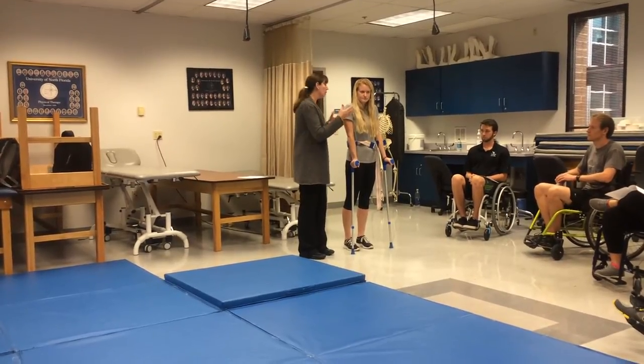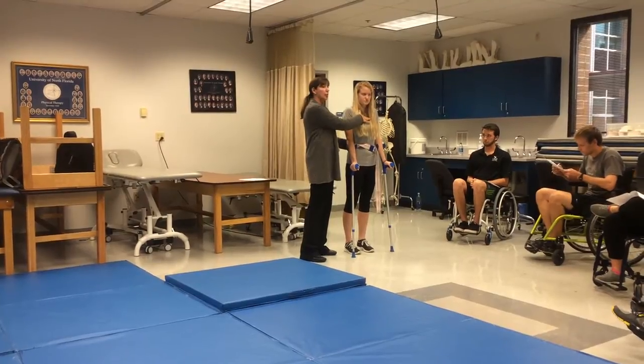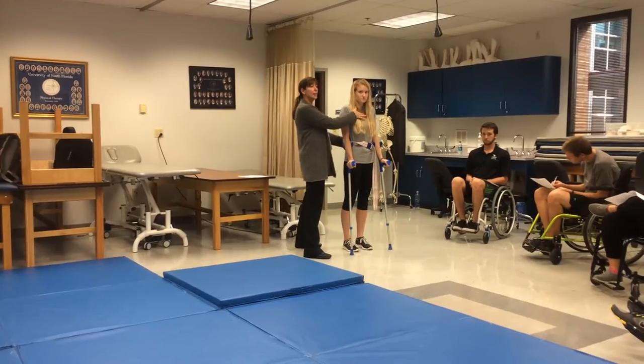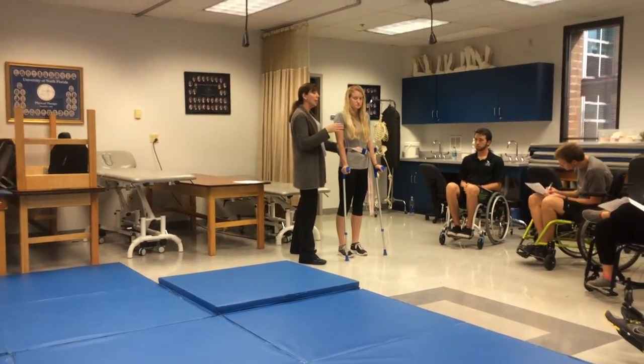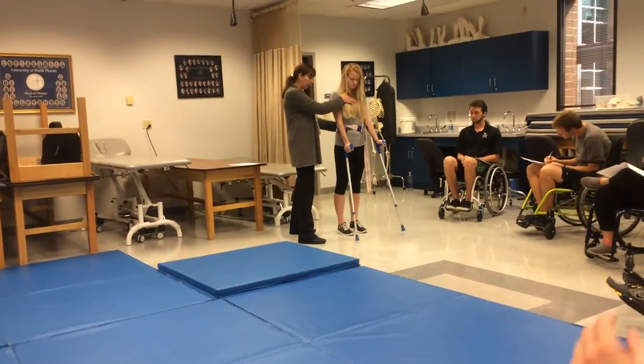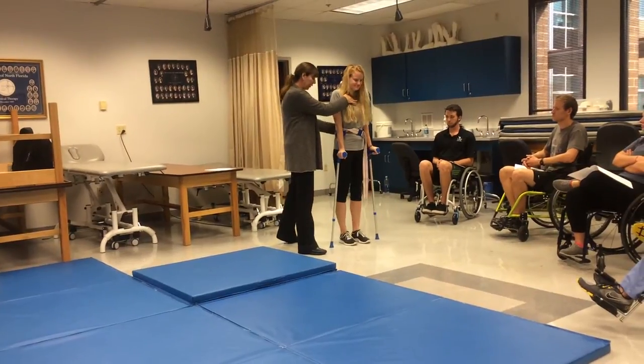She has no hip extensors, so I want to be by the low back, by the gait belt, and by the sternum — posterior-lateral to your patient with a good stance. This is how you guard your patient. You're going to progress both crutches together. Pretend your legs are in braces and just swing-to with your legs together.